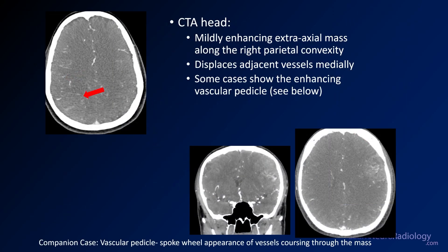The patient also had a CTA. We can see vasculature pushed to the side, but the mass itself isn't seen that well. In a companion case with a similar mass along the convexity, you can see a cluster of vessels centrally within the mass — that spoke-wheel vascular pattern is also typical for this diagnosis.